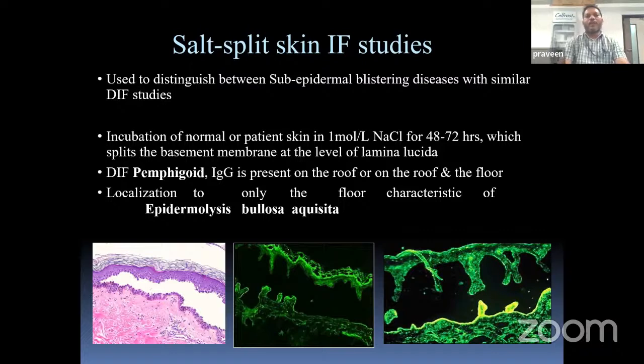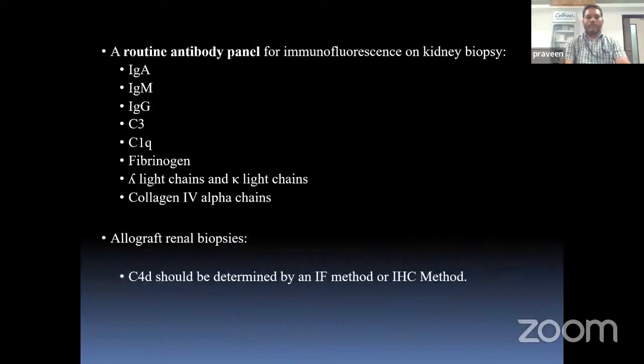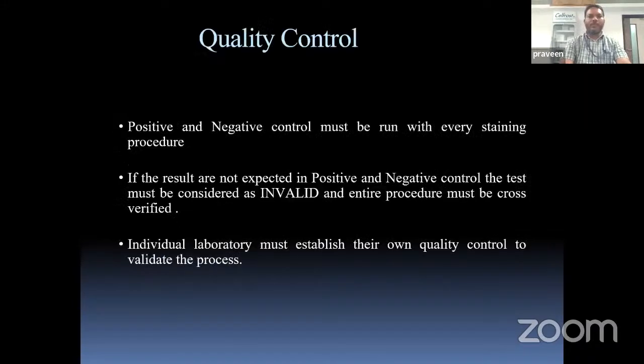Normal patient skin is incubated in 1 molar NaCl for 48 to 72 hours, which splits the basement layer at the level of the lamina lucida. The routine antibody panel for immunofluorescence on the biopsy we have previously discussed.